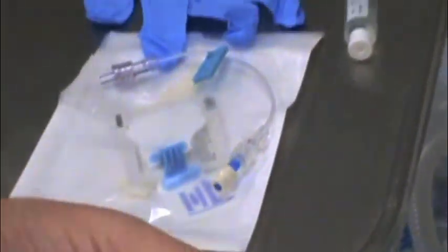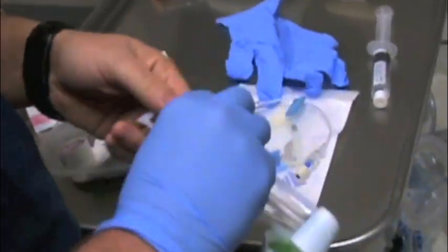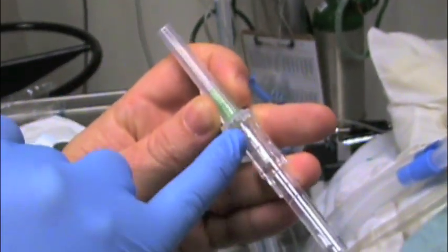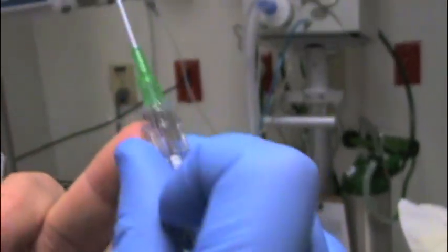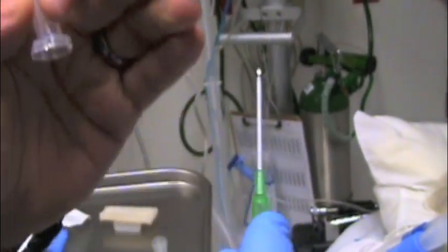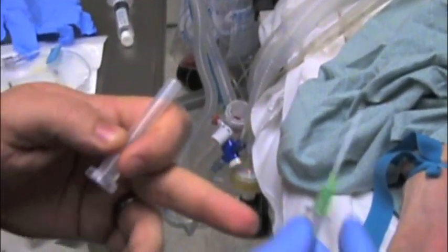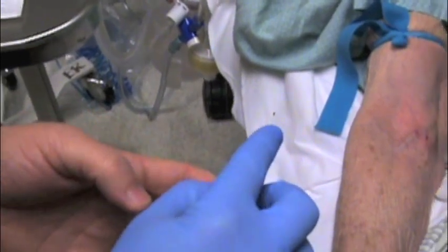The next step is cleaning the site. These days with these preps you don't really have to do it in concentric circles, but habit rules so I still do. When you get your IV in, you're going to see a flash right in here between the edge of the needle and this white spot — this is all going to fill up with blood, and that's how you know you've gotten inside the vessel. At that point, stop advancing the whole thing and push on this little lip and just advance the catheter. That pushes the catheter off the needle and pulls the needle out. Make sure as you go in that the bevel is up. If you go down, you may not get a flash. Always bevel up, and after you get your flash, stop advancing the whole thing and just advance the catheter.